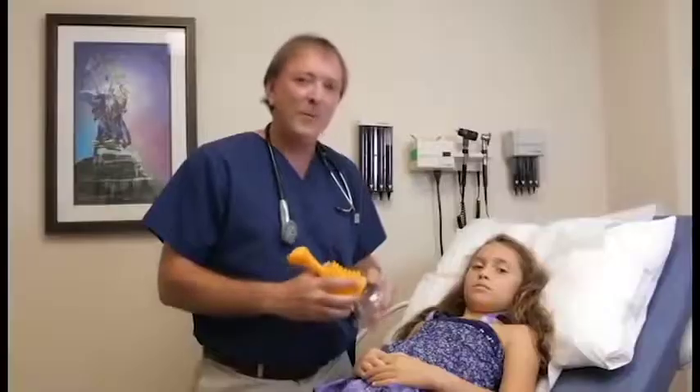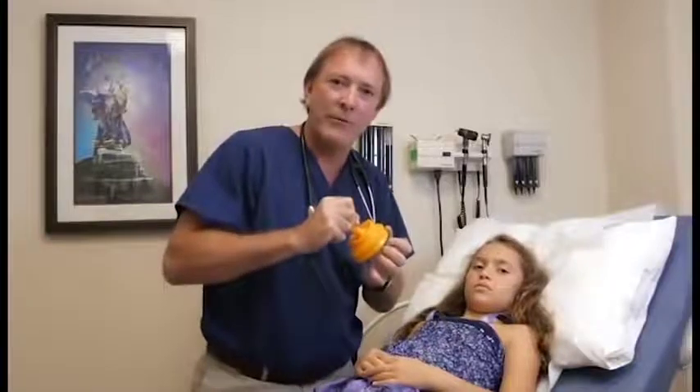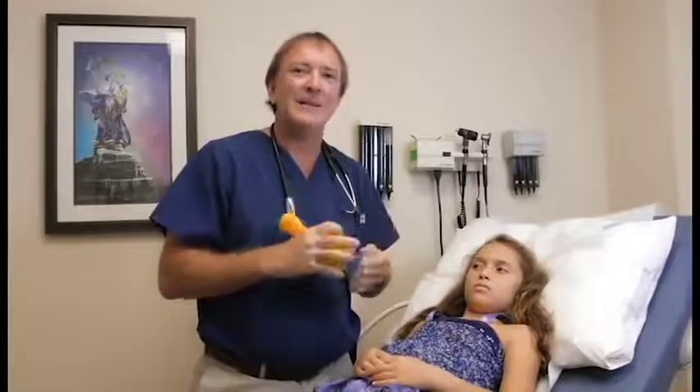LifeVac is simple: one, two, three. One — place the device on the patient. Two — compress it. Three — pull hard. It's that simple.